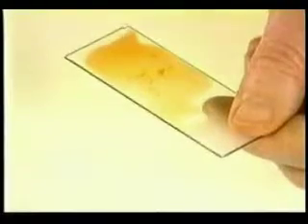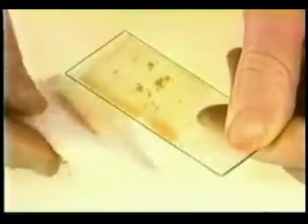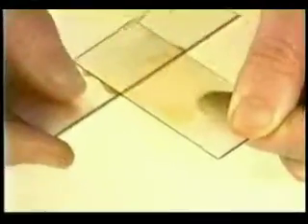A gauze pad can be used to absorb fluid by holding it up against a tilted slide. As soon as most of the fluid is absorbed, the material may be smeared. I have shown the basic sampling and smearing techniques. Now I will show them again, slowly and without interruption.